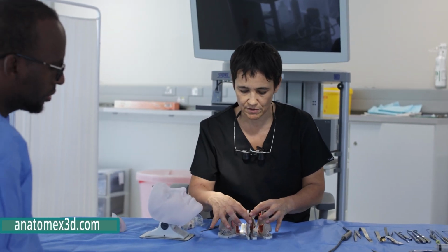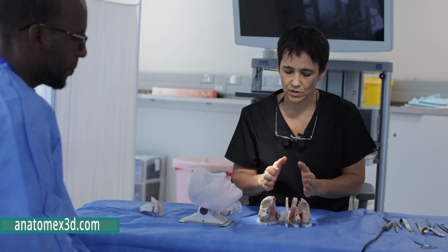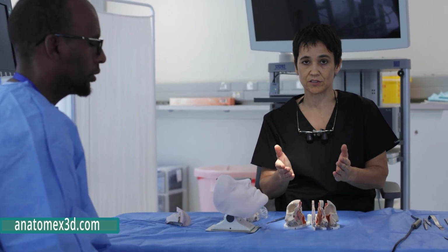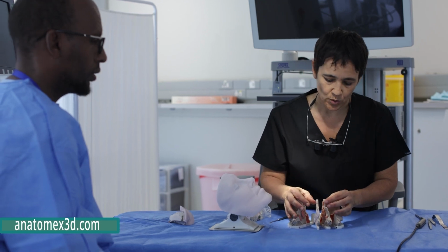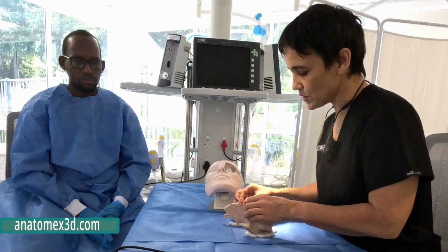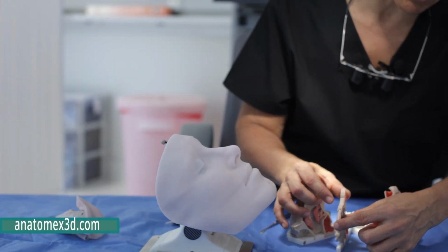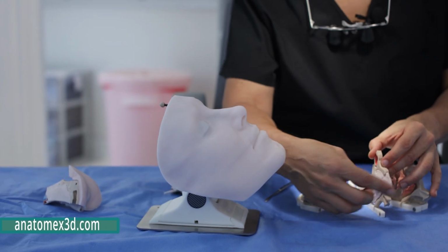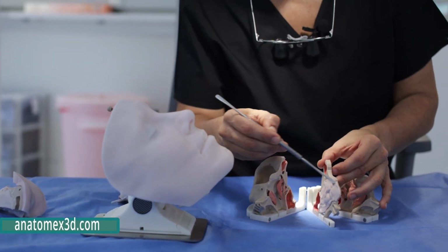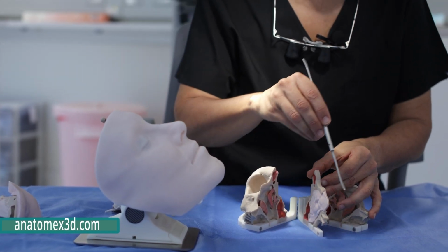If you look at the middle part, this is the nasal septum. In this model, our septum is slightly deviated towards the right side to help understand what a septoplasty, or septal correction surgery, would involve. You can see it contains bone and cartilage in the front part. On both sides of the nasal septum, you have nasal mucosa. So the septum consists of 3 layers: mucosa, bone or cartilage, and then mucosa.